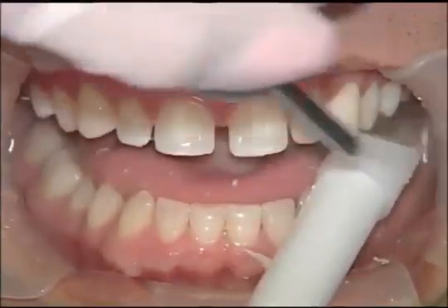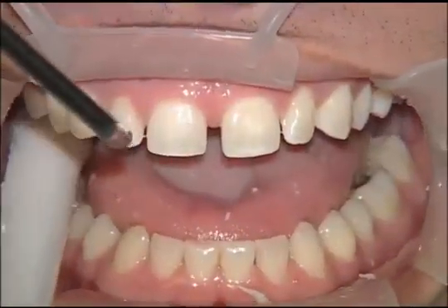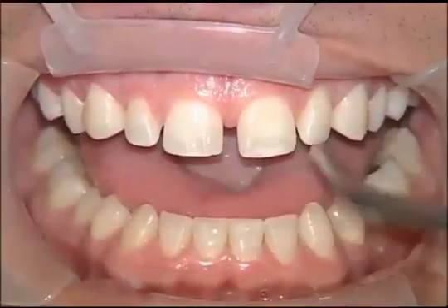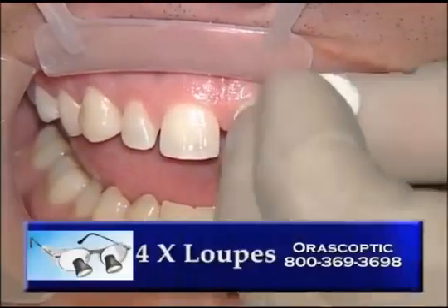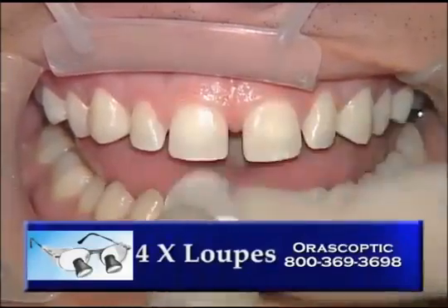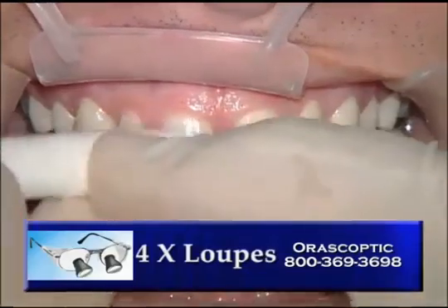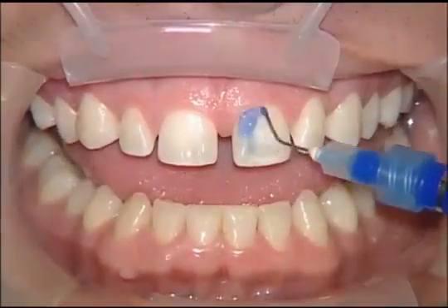So we're going to go ahead and rinse off the pumice at this point. And as we do that, we'll make sure that we don't have any extra clumps sitting anywhere, and then we'll go ahead and dry off the teeth. And I wear 4X loupes, high-res loupes from Orascoptic, and I'm really still able to see any pumice that might be in or around the tooth, especially around the gingival sulcus. It seems like we get some, so a cotton roll does a good job of removing that.